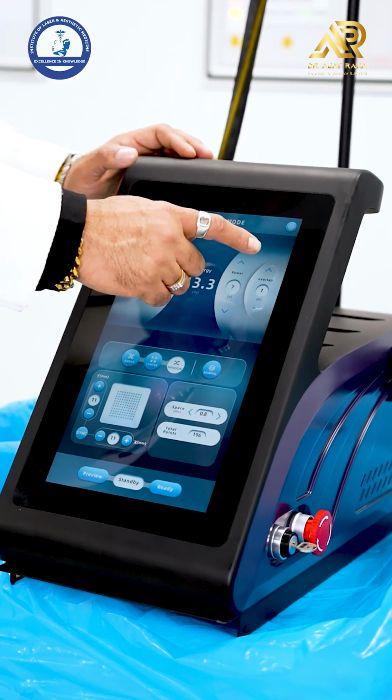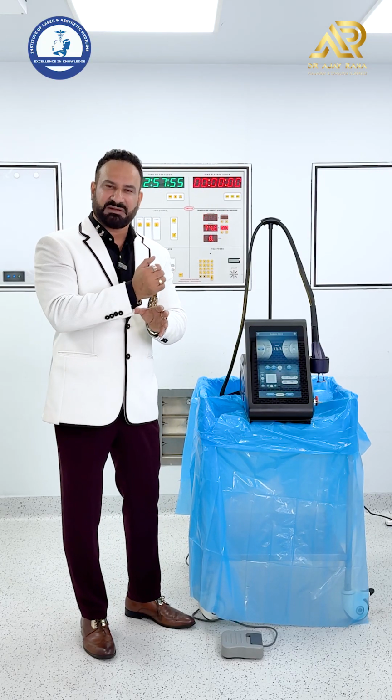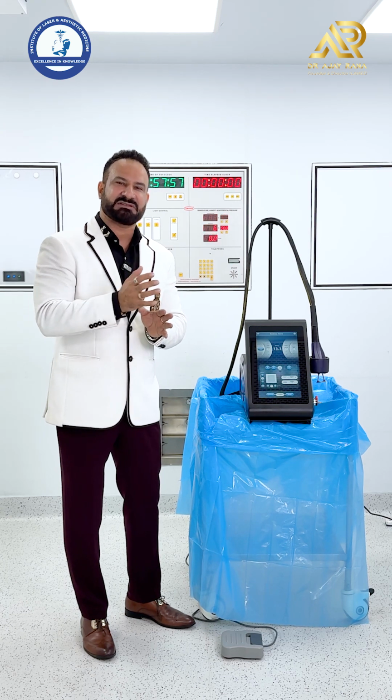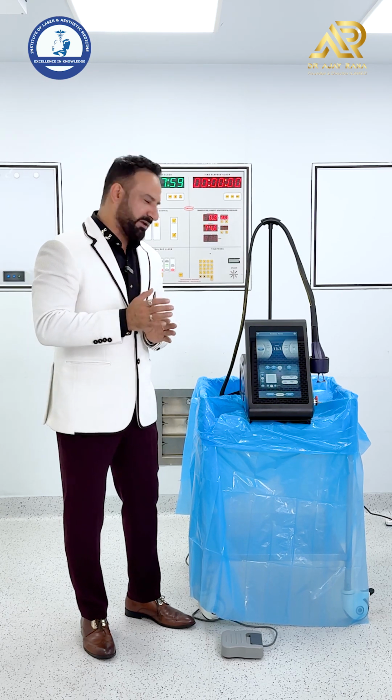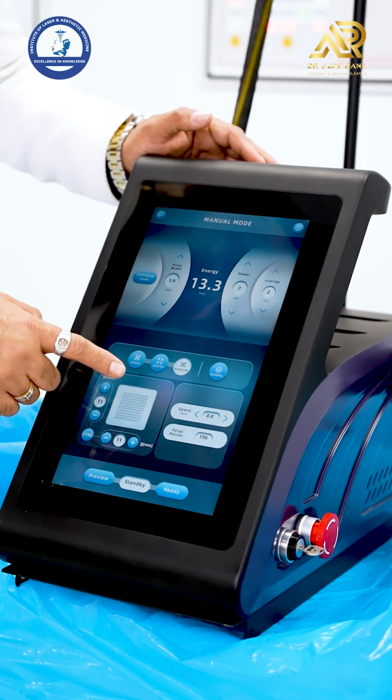You can press and make the overlap twice. That means when you are firing, the system will complete one fire and automatically start to fire a second time. So double pass, it will fire in 2 passes. And then there is a pattern formation.